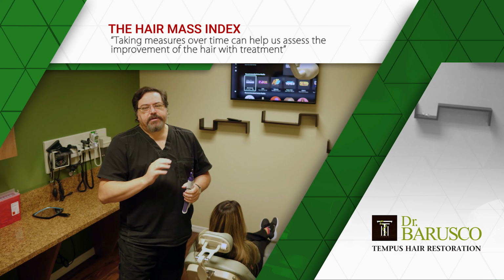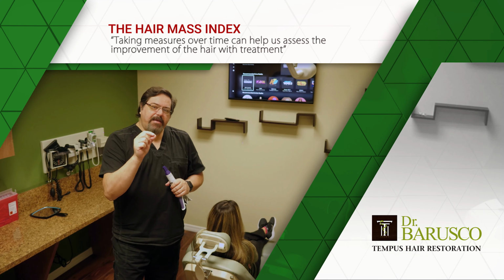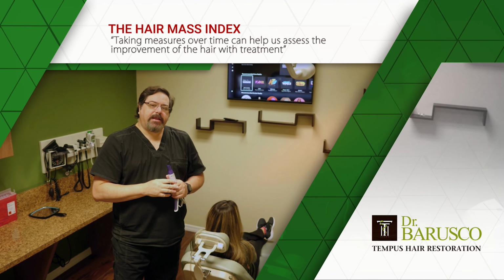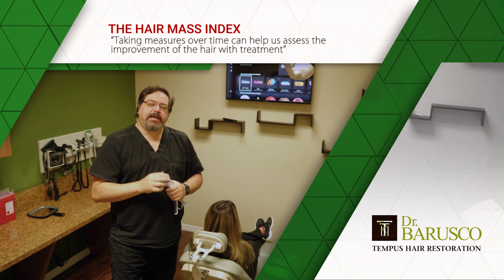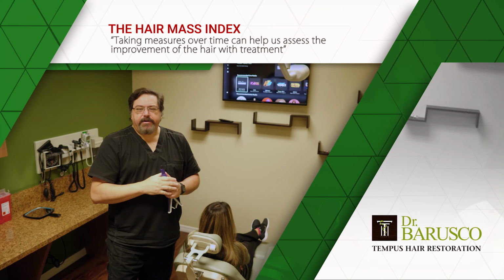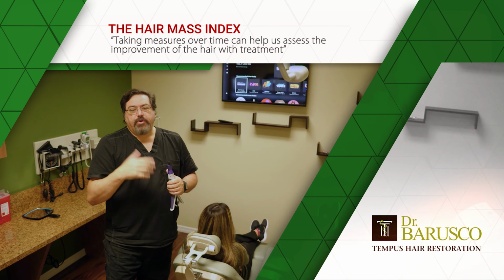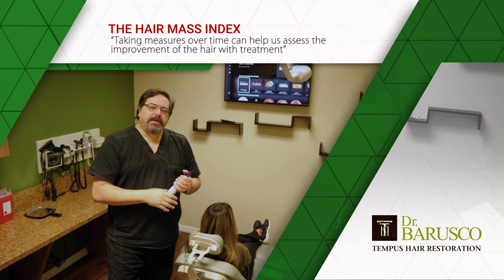As I said before, the hair mass index measures two things. One, the diameter or thickness of every hair strand, so whether a hair is this or this, you're going to measure that thickness or diameter, and also the amount of hair that's in there. Those two numbers are going to be growing, hopefully getting better and better as we progress with the treatment and her hair gets thicker and thicker.